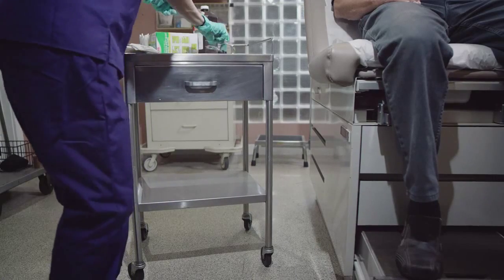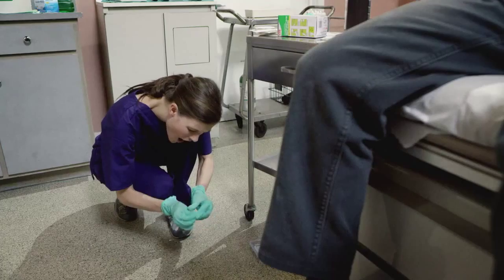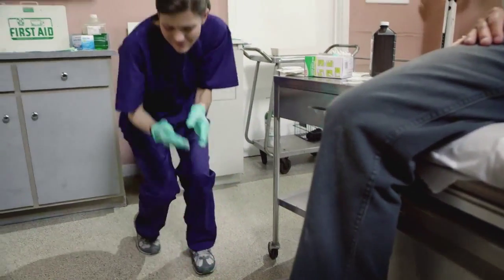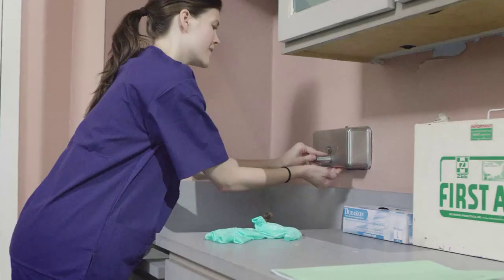The removed staples are often times knocked over. At some point in their career, healthcare workers will be pricked by a staple, and this spreads disease. These types of injuries occur about 385,000 times every year, and only half are reported. Linda has just been infected with hepatitis C.